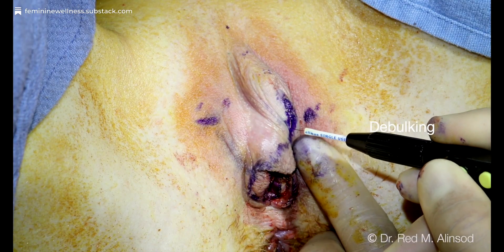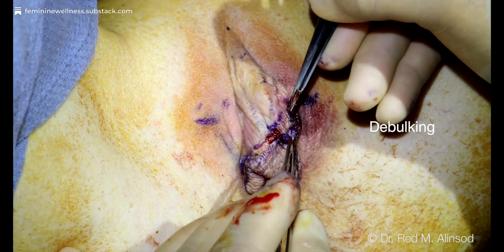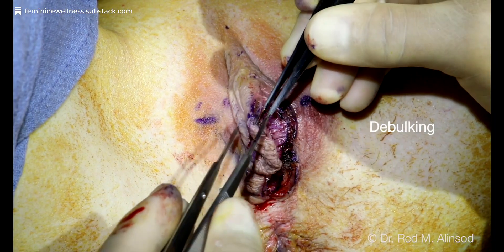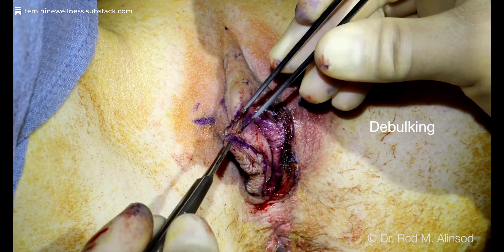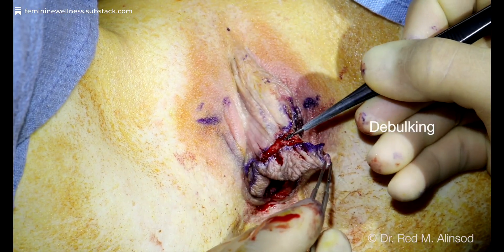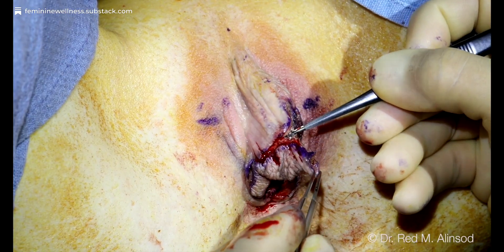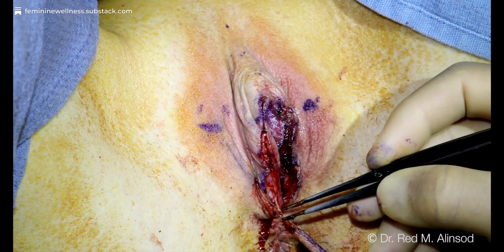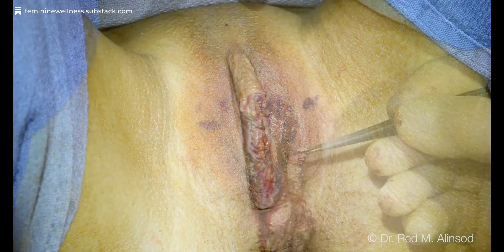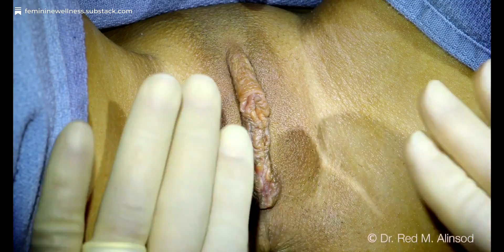You can see here, using this right below the clitoris, right on the frenulum, and you can use this for precise surgery or more debulking procedures. You can see this patient has a very bulky labia minora, and I'm able to control the bleeding with this bipolar cautery. If I still have bleeding, I pull out my standard cautery unit.